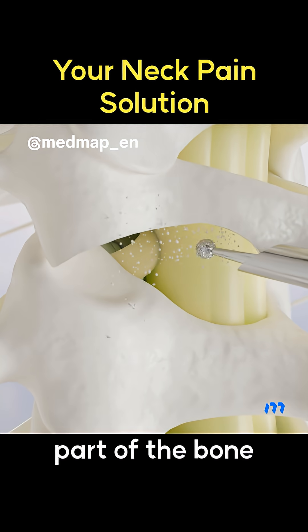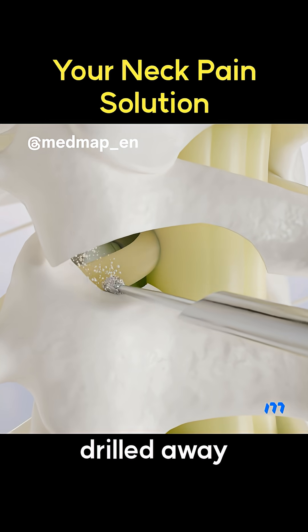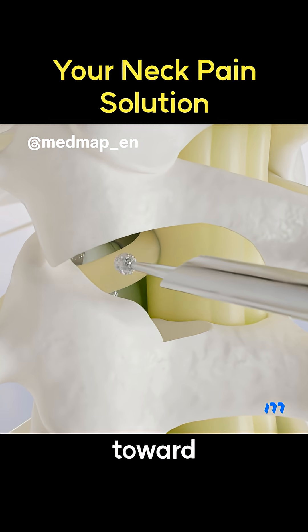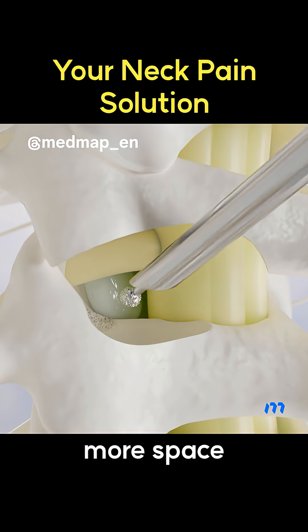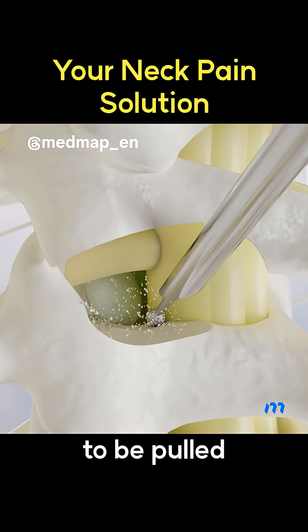Next, a small part of the bone around the foramen is drilled away to make a clean, safe tunnel toward the nerve. Removing a bit of the surrounding bone creates more space, so the nerve doesn't have to be pulled or stretched.